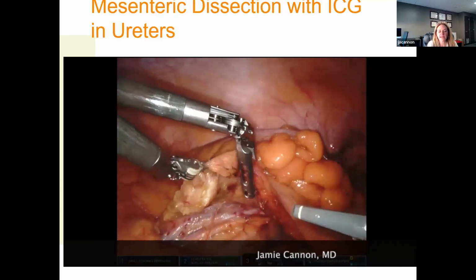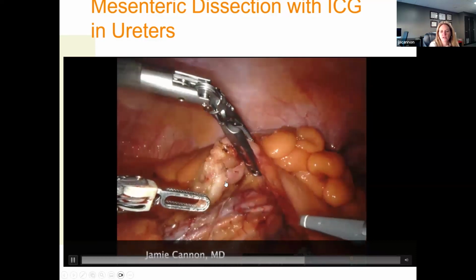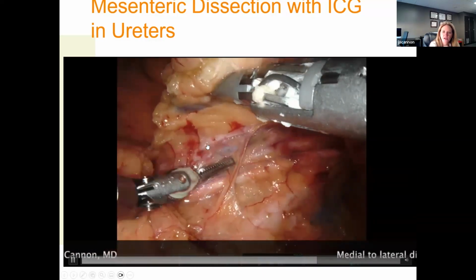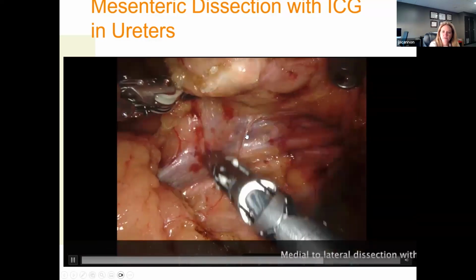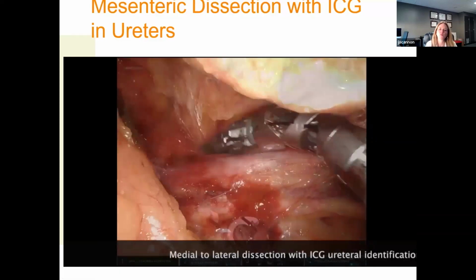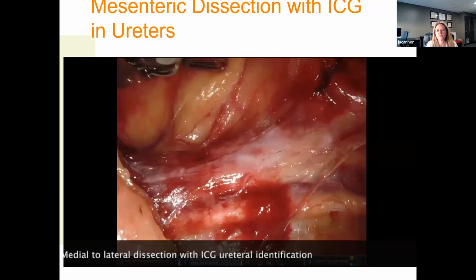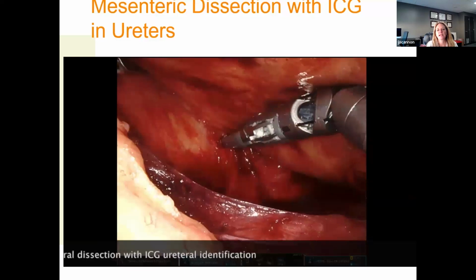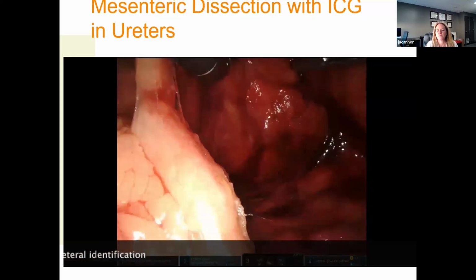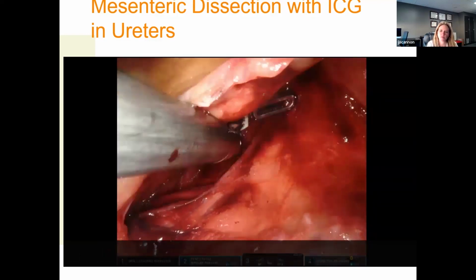Once the IMA has been divided, I'll generally get my grasping retractor down here to hold up the redundant mesentery that we've already divided. And then my bipolar will come underneath, and I'm identifying that junction right between mesentery and retroperitoneum, and my bipolar will tent that up. And then my vessel sealer will push the retroperitoneum down, and we continue to work out laterally underneath the sigmoid colon to develop that plane, and then continue to work up towards the head, up towards the inferior border of the pancreas, in order to work up towards the transverse colon and get the colon completely mobilized.